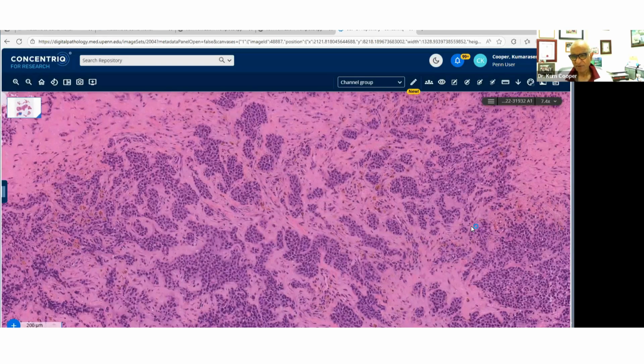We talked about alveolar rhabdomyosarcoma, and then clear cell sarcoma, as you know, typically has this nested pattern. They can sometimes be spindled, and this pattern is very reminiscent of that, along with all the other tumors, like you said, metastatic carcinoma, alveolar rhabdomyosarcoma, NET, pseudoendocrine sarcoma, the entire list that you guys have been going through so beautifully, including myoepithelioma.